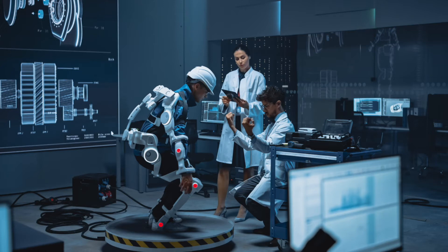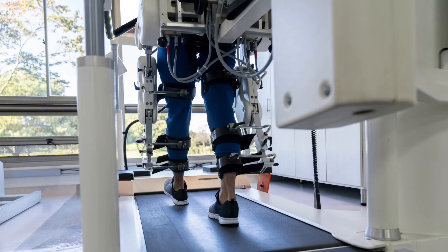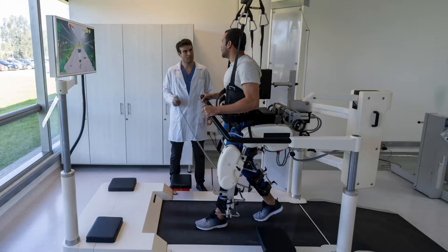In conclusion, lower limb exoskeleton robots provide assistance and rehabilitation to lower extremity joints, or they can be used in gait training. These robots provide therapy, protection, support, and assistance to reduce burden on the limbs and assist patients to complete activities of daily living, or ADL.